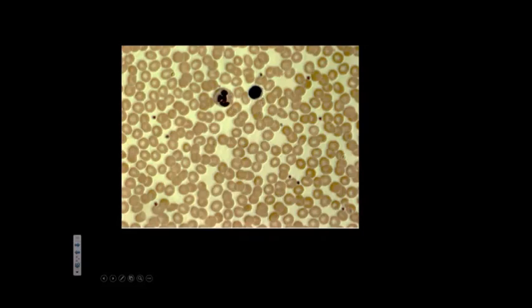Neutrophil, lymphocyte. This looks like it's bigger. Monocyte. So here's a good example of comparison between a monocyte and a lymphocyte in terms of their size. Okay. Has some red down here, so I would lean towards eosinophil, but I wouldn't punish myself by calling it a basophil either.